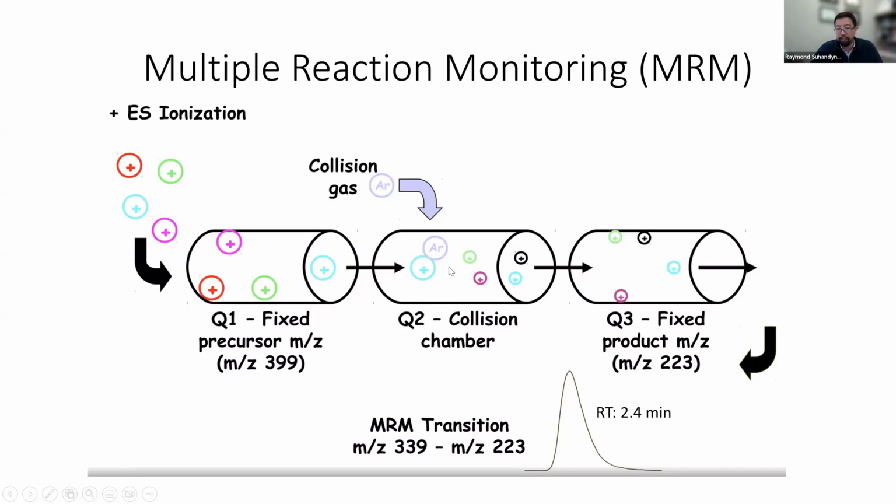I won't get into the details of that, but this is where you generate something called transitions, and it's basically a daughter ion of the 399 ion. What we're actually monitoring in multiple reaction monitoring is those daughter ions. So you get extreme specificity and extremely good signal to noise. The reason we're able to measure things down into even the low picogram per mil range in samples and biological matrices is because we have direct transmission of the ions through, and we're removing all the noise.